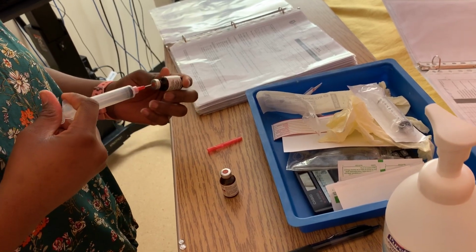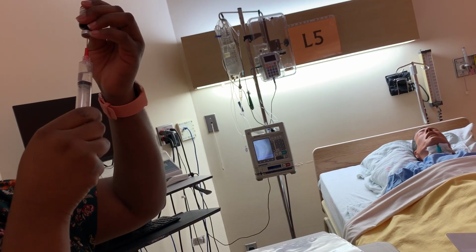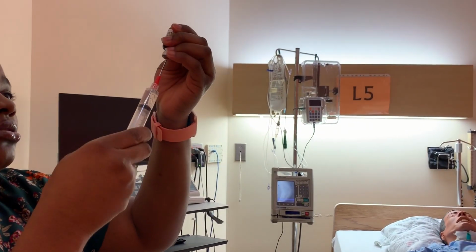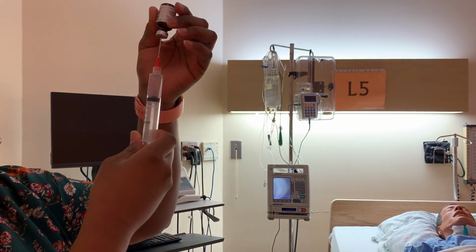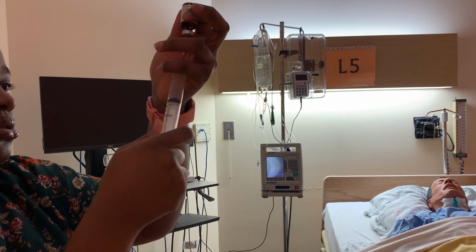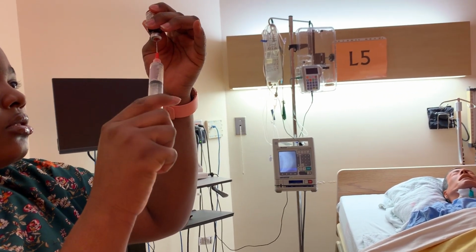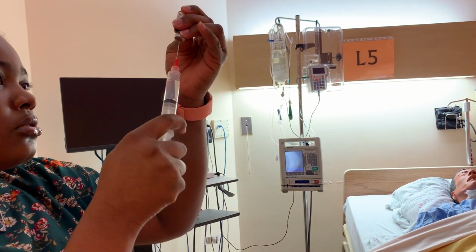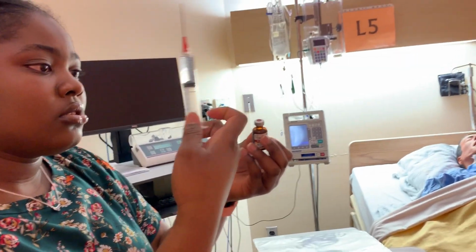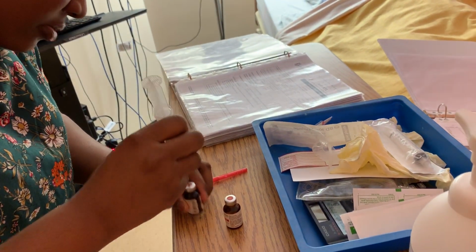I'm going to inject the air. Bring out 5, making sure there are no air bubbles. So I'm just going to inject it again, just to make sure I get up to 5.